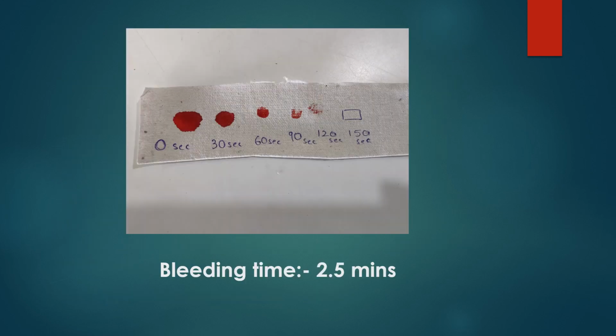As I have explained in the previous slide, put the first drop on filter paper at 0 seconds, and then after 30 seconds put the second drop. You have to just touch your finger to the filter paper. Now repeat this procedure until the bleeding ceases. Now count the number of spots and then multiply it by 0.5. So here there are 5 blood spots.